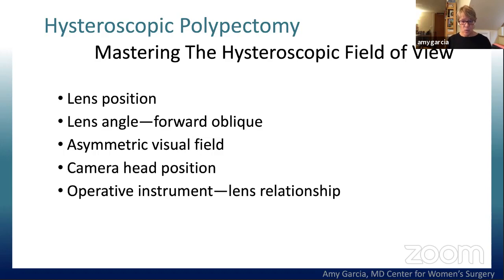And that is where the lens is in your visual field, the lens angle that you're using, and what visual field it creates. Being very mindful of the camera head itself, and once an operative instrument is brought into the visual field, really understanding the instrument and lens relationship.